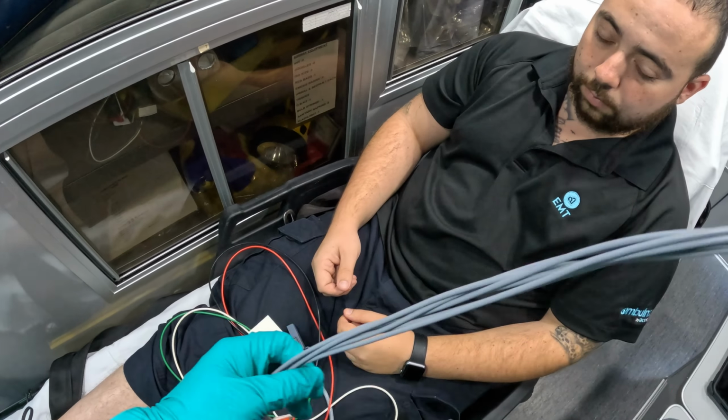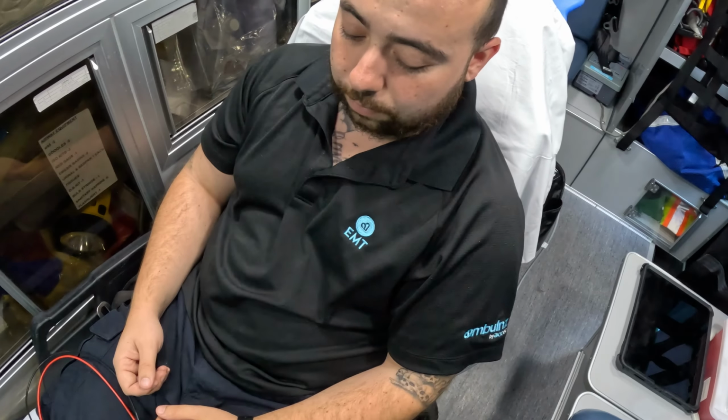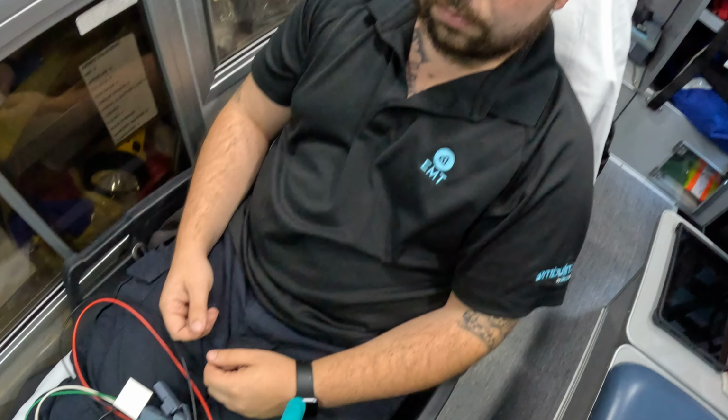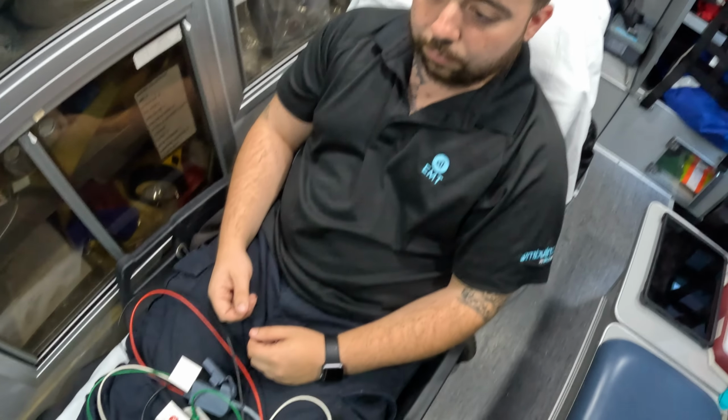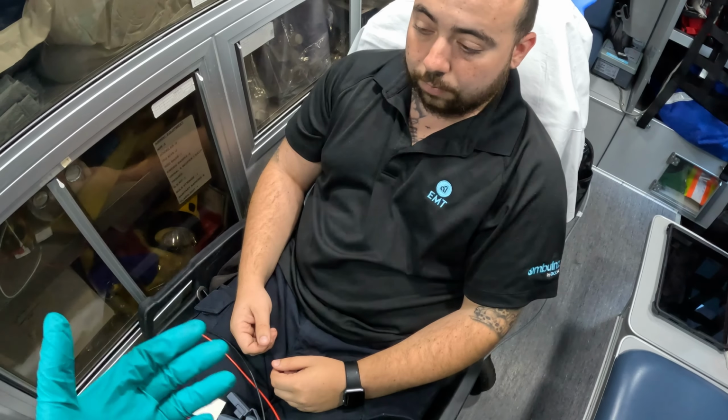So first thing I like to do is I come in, I introduce myself. Hello, sir, my name is Nikolai. Right, you're going to say you're an EMT. I'm here to do a cardiogram, which is going to take a look at your heart. Is that okay? Patient will say, yeah, no problem. Or a patient's altered mental status, they're intubated, right? But still, you want to make sure you say it. I usually also like to check their armband, make sure you're doing this on the right patient. The last thing you want to do is get a 12 lead on the wrong patient. So verify their date of birth, their name, right? And their consent. So patient is ready.